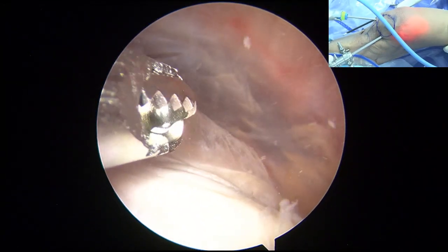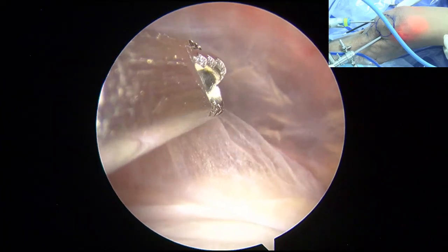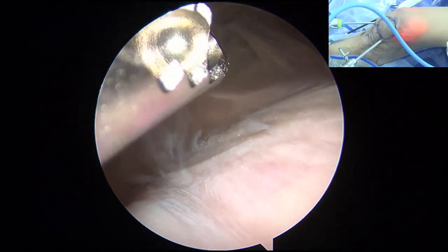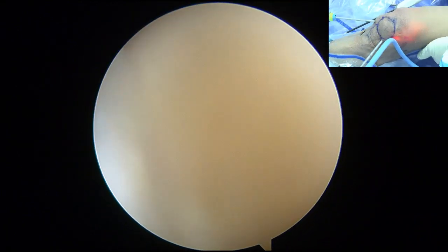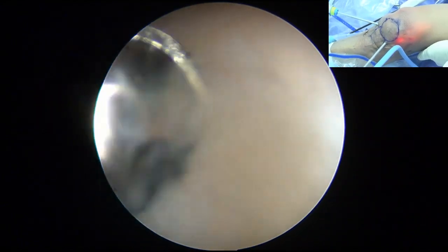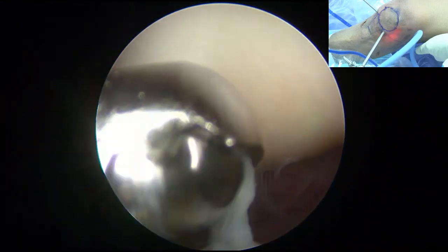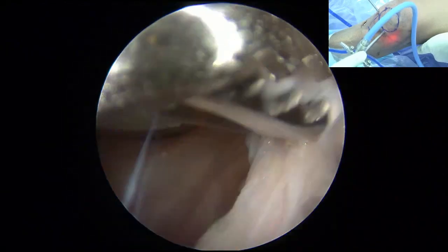Because this is a big room, you always see each other in this area. In patients that have acute injury with a lot of bleeding, or a lot of fat tissue, you can go to this meeting point first, and then slowly drag your camera that way and slowly go down. The middle is like a meeting point. Once the instruments are at the meeting point, you shave the tissue in front. This technique works really well. Okay, you can see the mucosum. You can take this out.